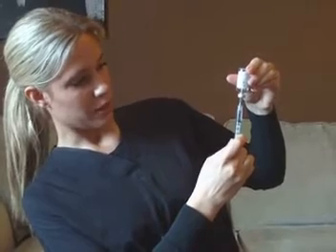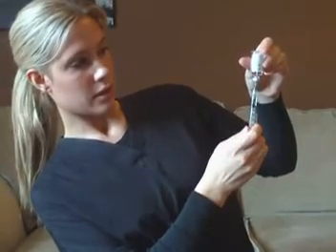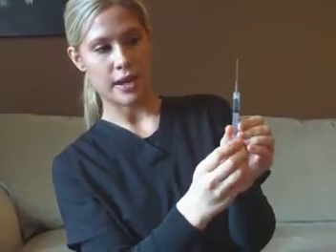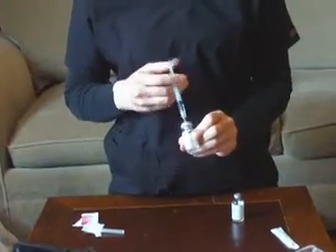And if you get a bunch of air bubbles, it's okay to overdraw and push them out, just like I just did. So I have here 1 ml of water — the top of the syringe lines up with the line of the 1. And I'm going to inject this full ml of water into the powder.